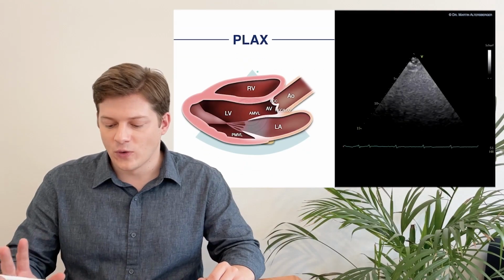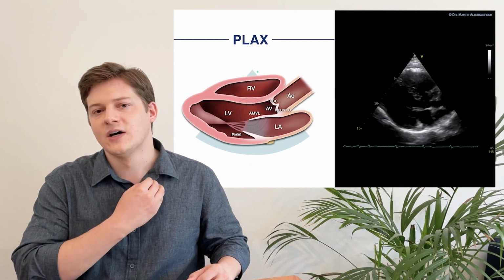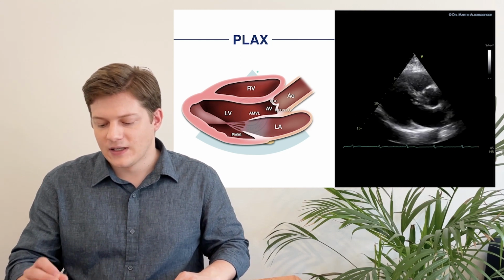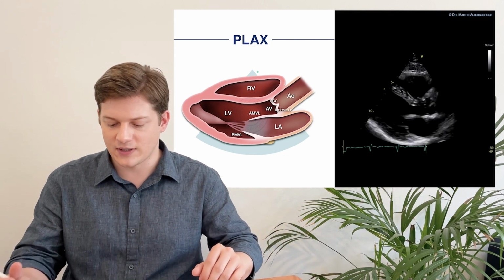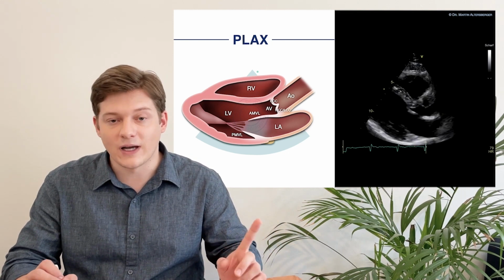Moving on to normal anatomy, as I told you, and you can see it in this loop quite nicely, start always at the clavicle. Move down the clavicle until you reach this view. As soon as you reach the heart, you do stop and take a bit of time to evaluate the normal anatomy again. What we can see here is close to the transducer, the right ventricle.